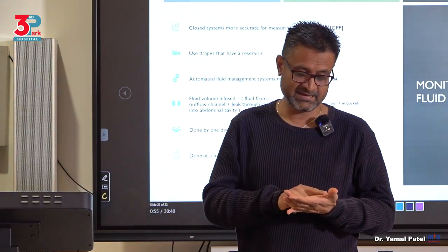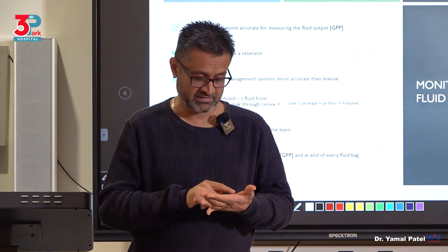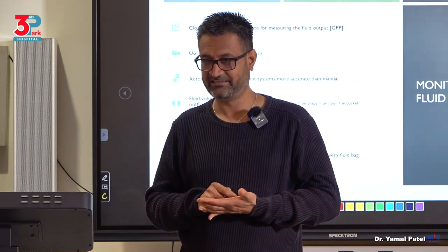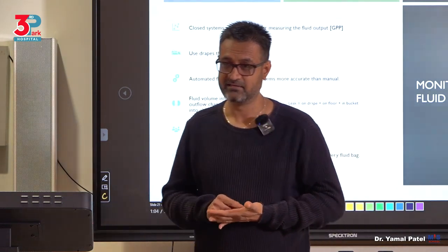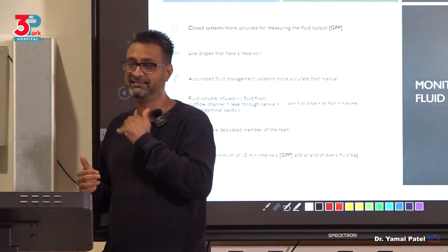When she says, right now, doc, 8 liters used, I'm missing 2.5 liters, cut off the procedure. End of story. So you get what I'm saying? That is how it should ideally be done, okay?